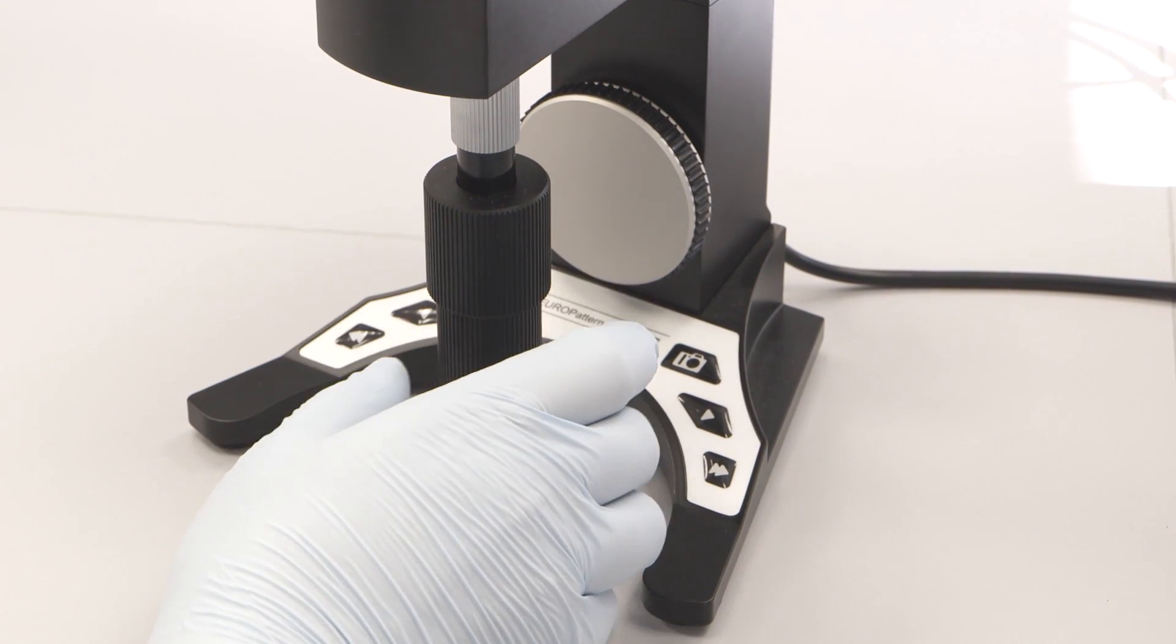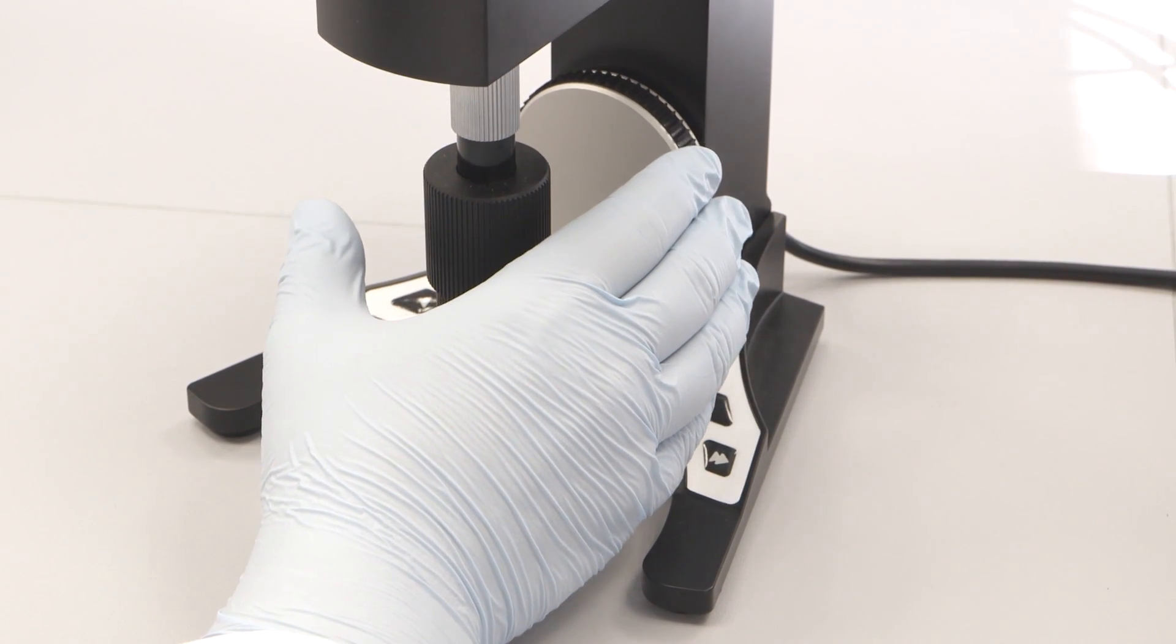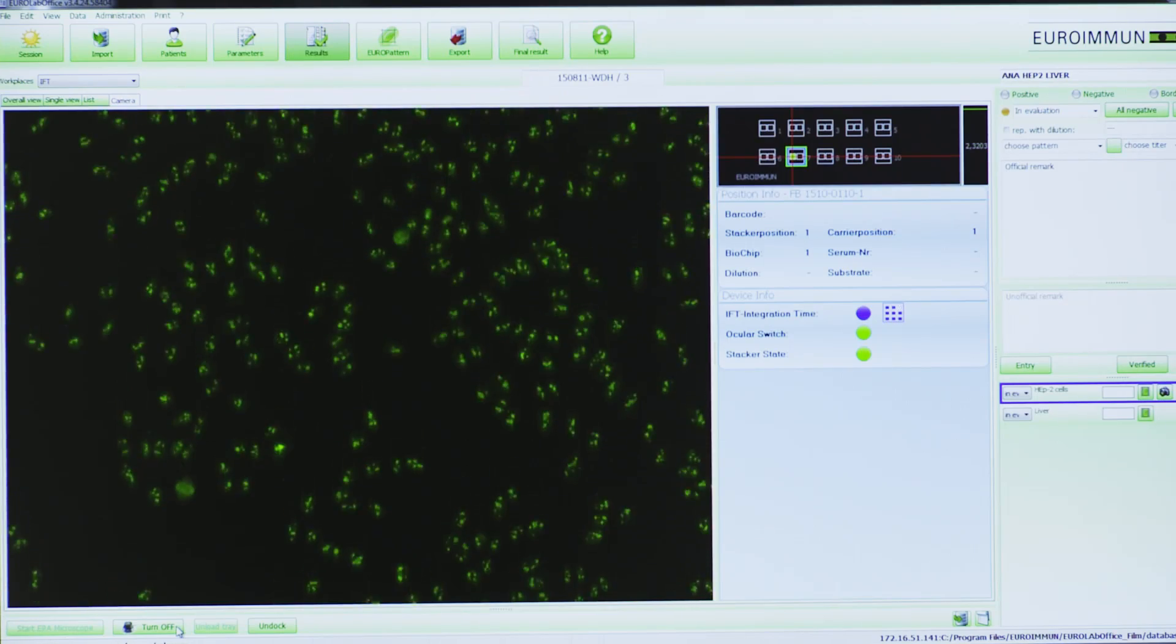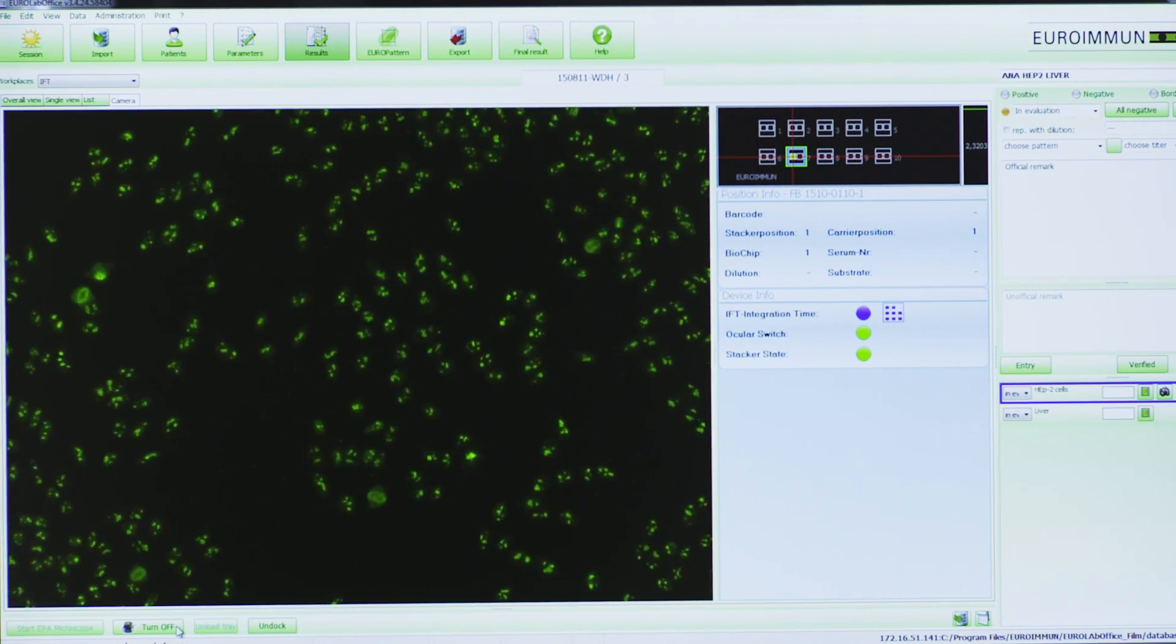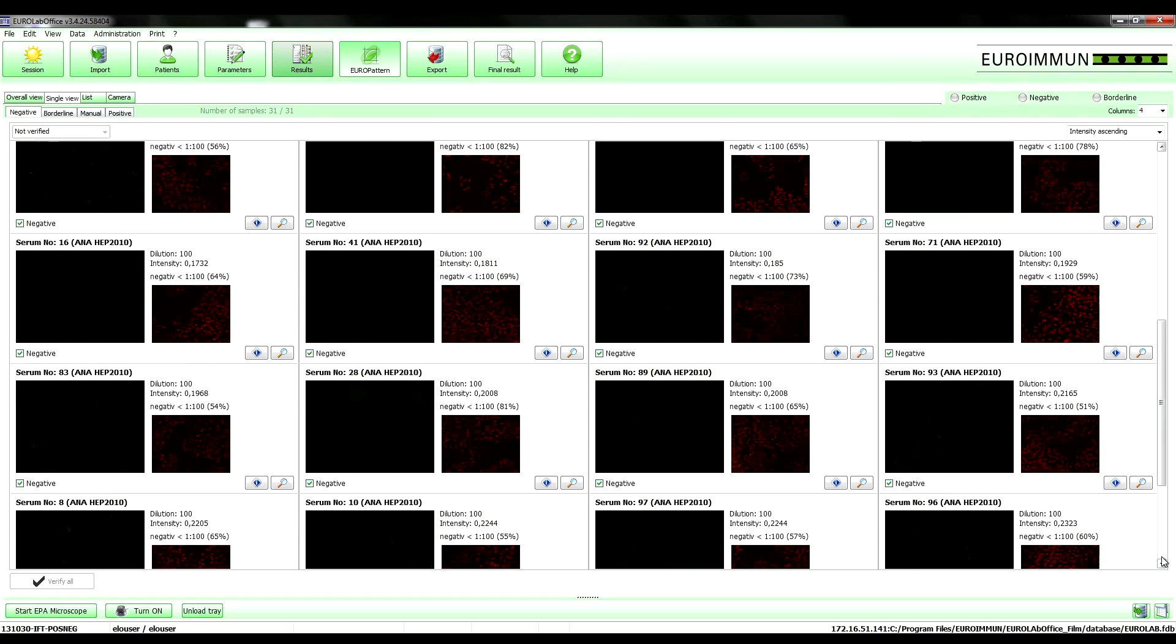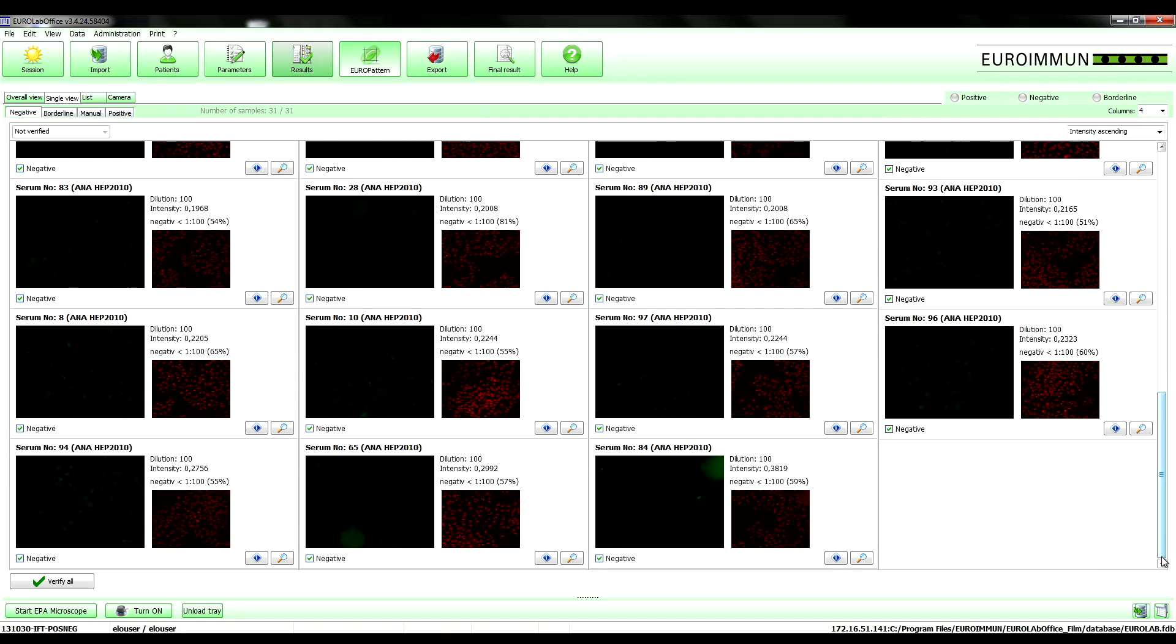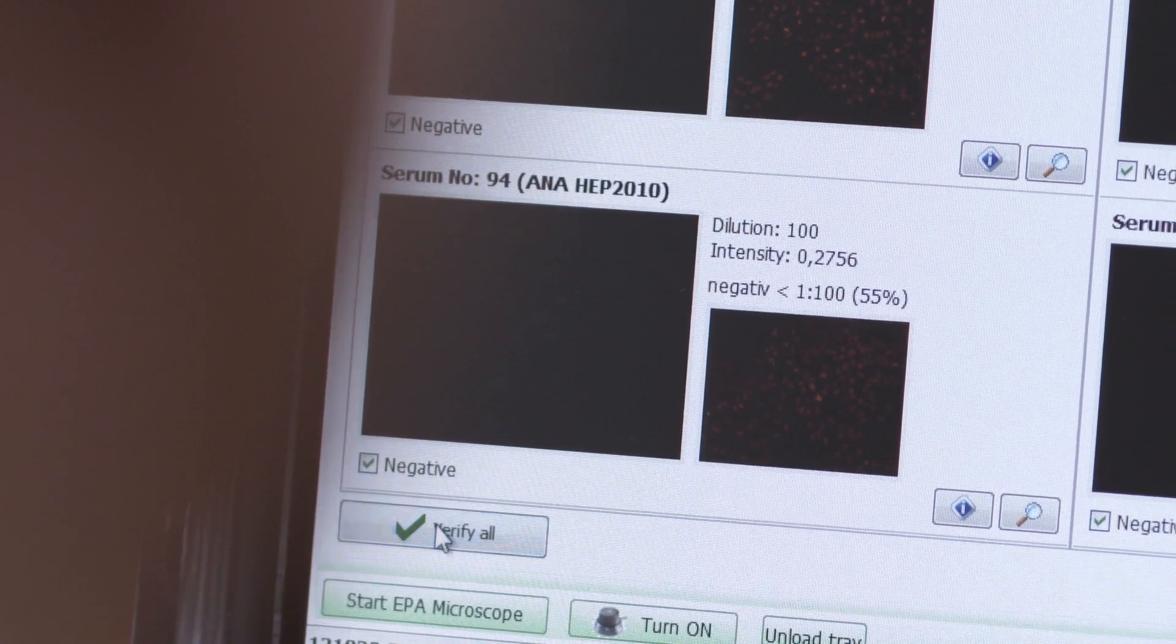Samples which are difficult to evaluate can be comfortably investigated in the live mode. Due to the network integrated software, diagnosis can be made at any workplace. The evaluation of results is possible already when the microscope is still working.